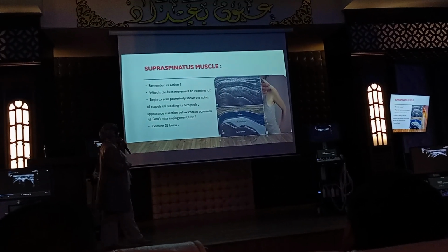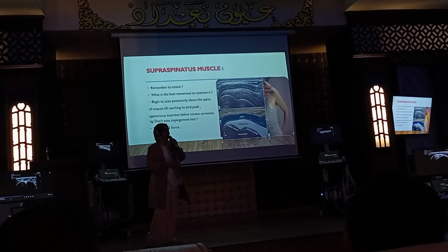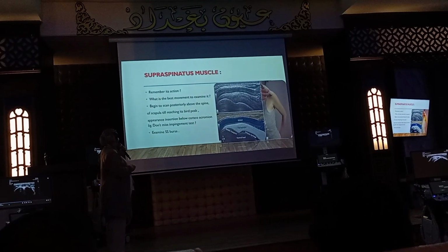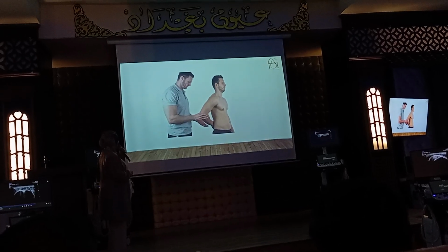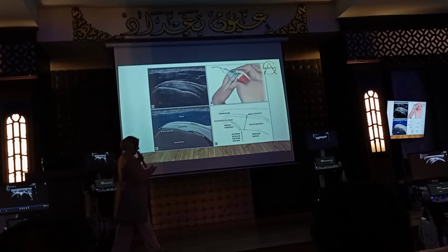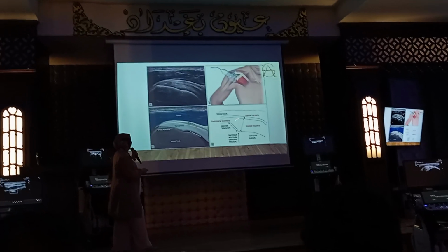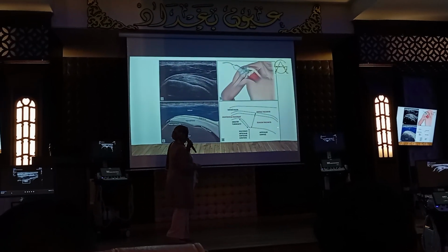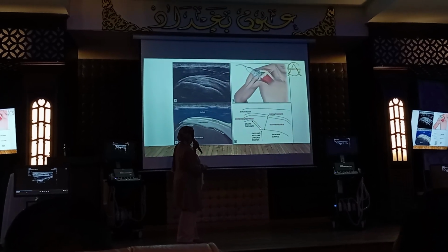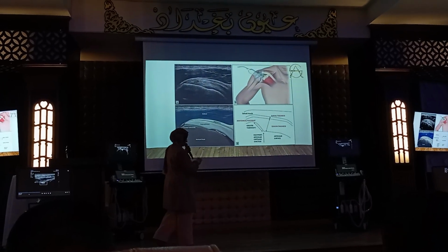So its action is abduction, and we do the examination by moving against its normal action, by doing adduction. This movement. This is also the supraspinatus muscle. I begin from here, then continue until I reach the footprint of the greater tuberosity.